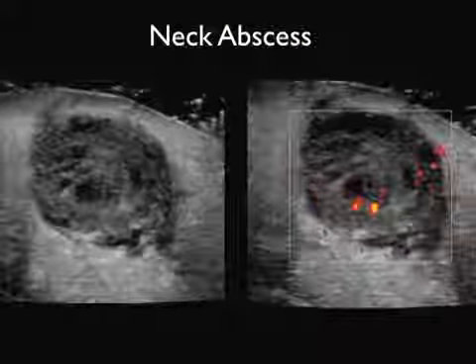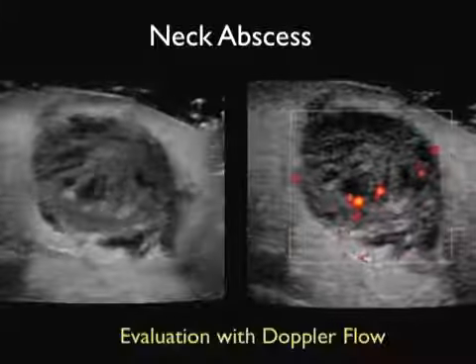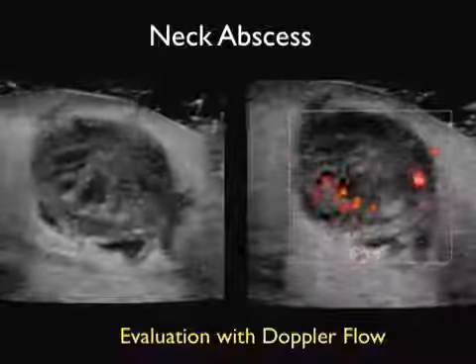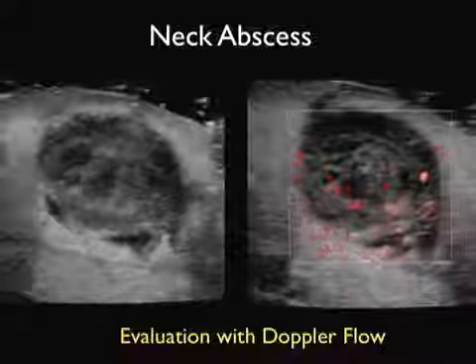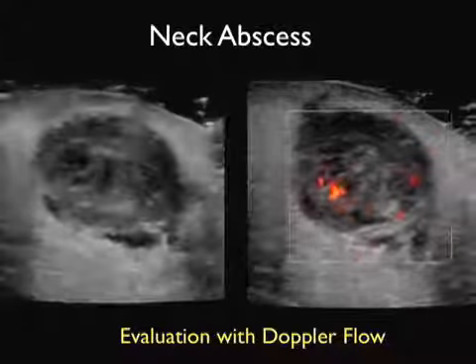Here's a sonographic appearance of a pus cavity that's developed underneath the patient's chin on the anterior neck. And we're looking with B mode or grayscale imaging to the left, and we see the classic appearance of a pus ball. And now we're going to put Doppler flow on the image to the right.